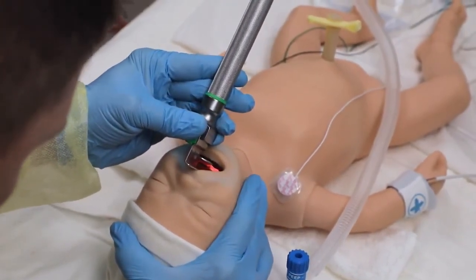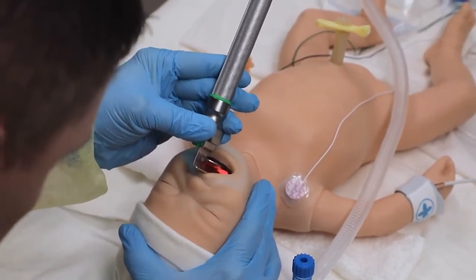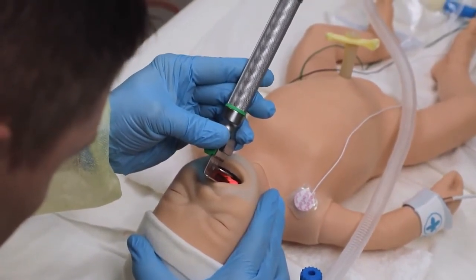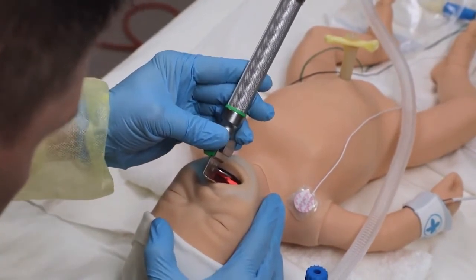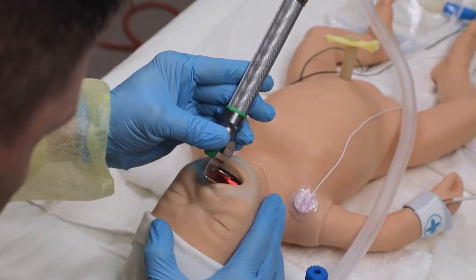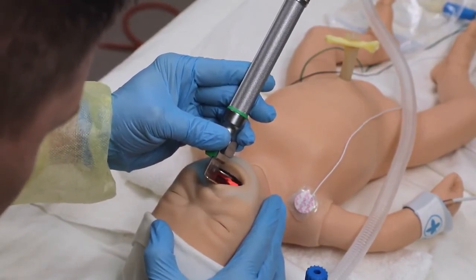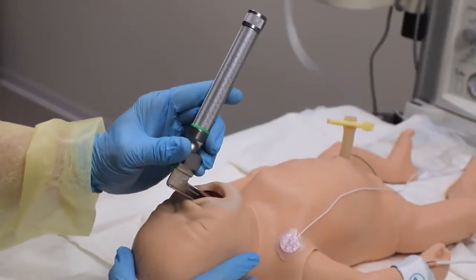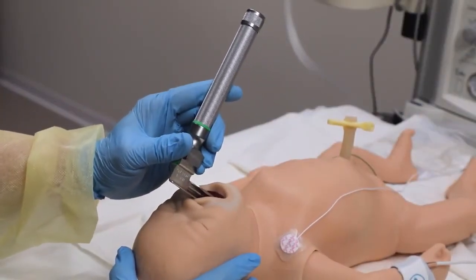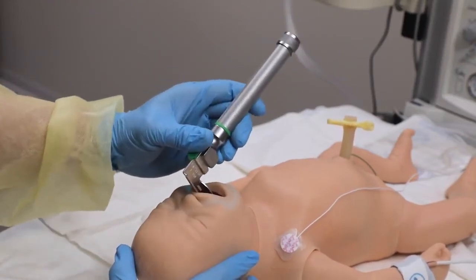Gently push the tongue toward the left and advance the blade until the tip lies just beyond the base of the tongue in the vallecula. Lift the laryngoscope and blade to expose the pharyngeal area. Raise your arm, but do not bend or rotate your wrist. Your wrist should remain stable. When lifting the laryngoscope blade, do not pull the top of the handle or rock the blade, which may injure the baby's lips and gums.